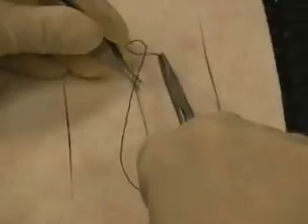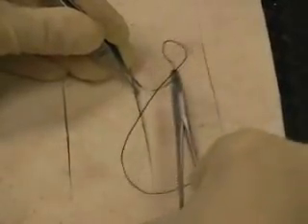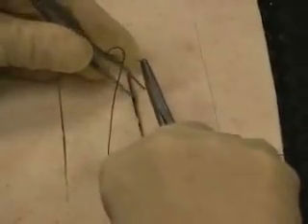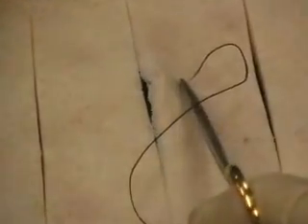You're going to try to enter as close to 90 degrees as possible, which is basically straight up and down. So you want to avoid coming through at an angle like this, but really as far as possible, straight up and down. And we're going to come out, and you notice where we came out here, obviously this would be connected down below, but we want to come out not underneath the laceration, but at the very lower portion.